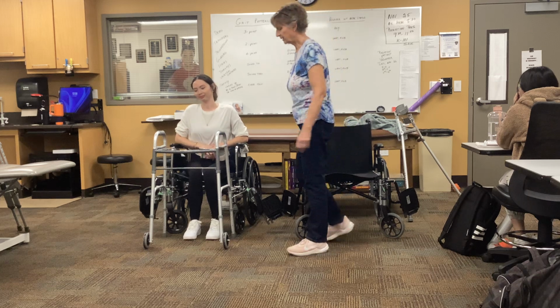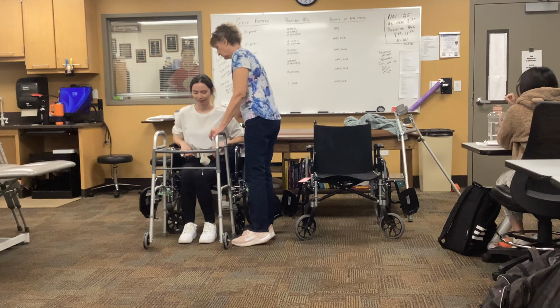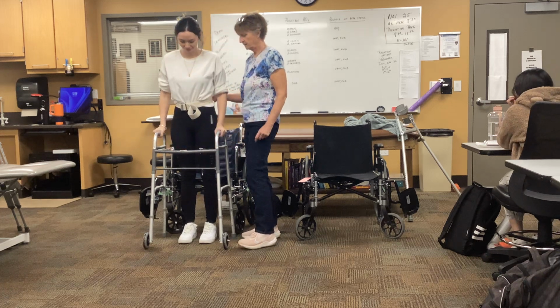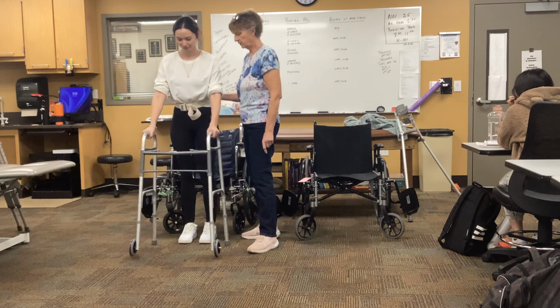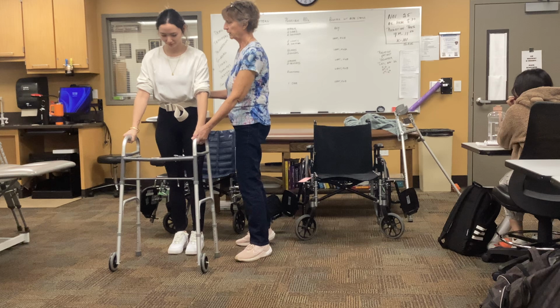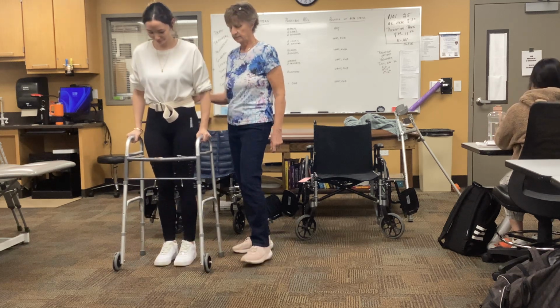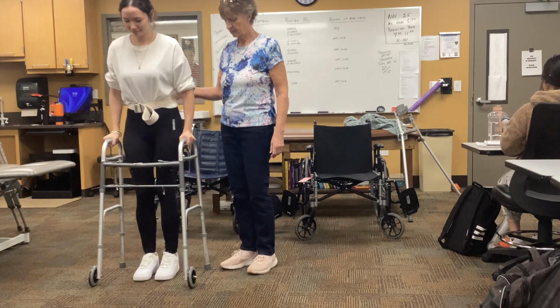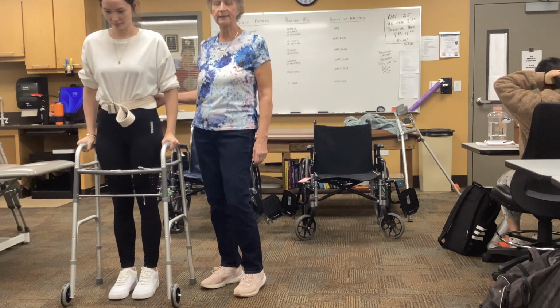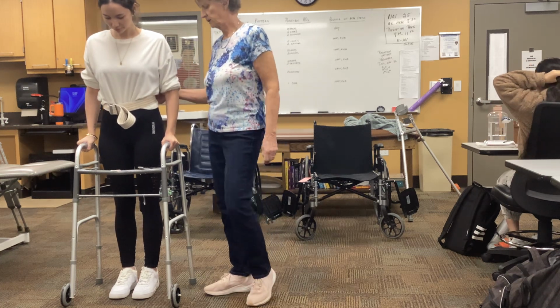Right. All right, so let's do it with the walker now. Please scoot to the edge, push yourself up. So move the walker forward. Okay, hop to the middle. This one's got wheels on it, so we don't need to pick it up. Okay, hop to the middle. Hop to the middle. All right, so that's a swing 2 gait with the walker. Okay, let's look at swing through.